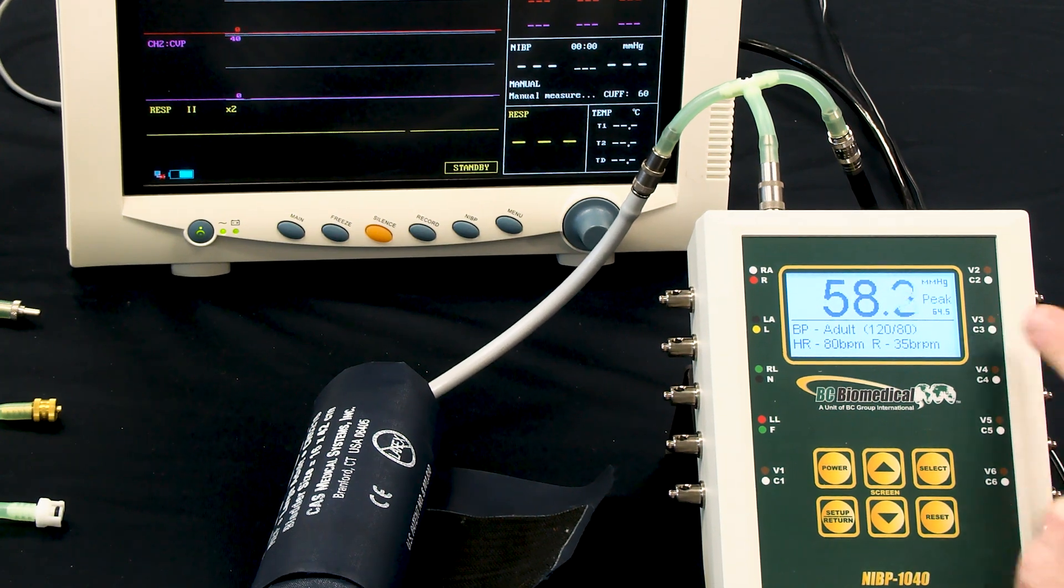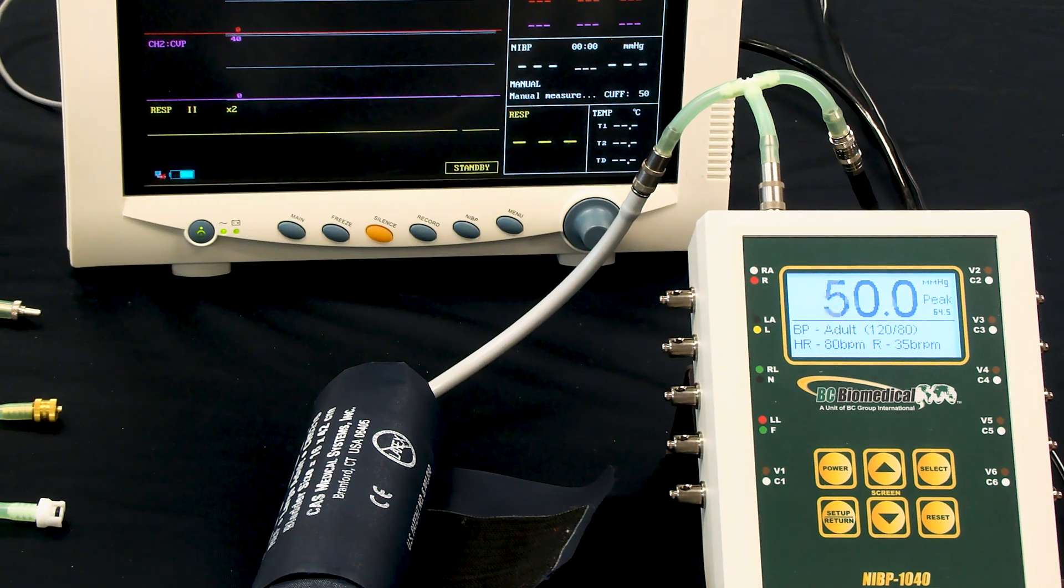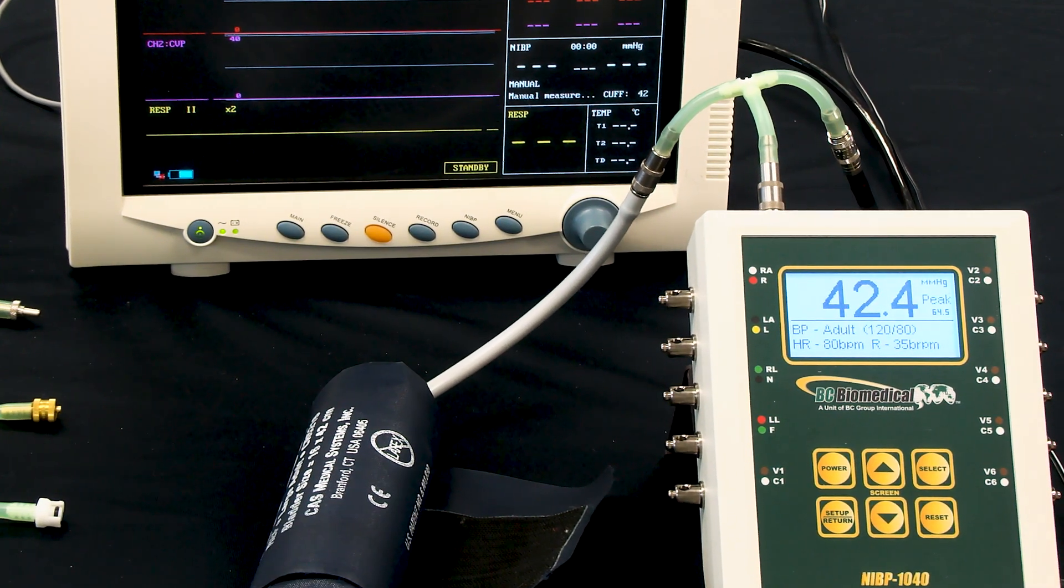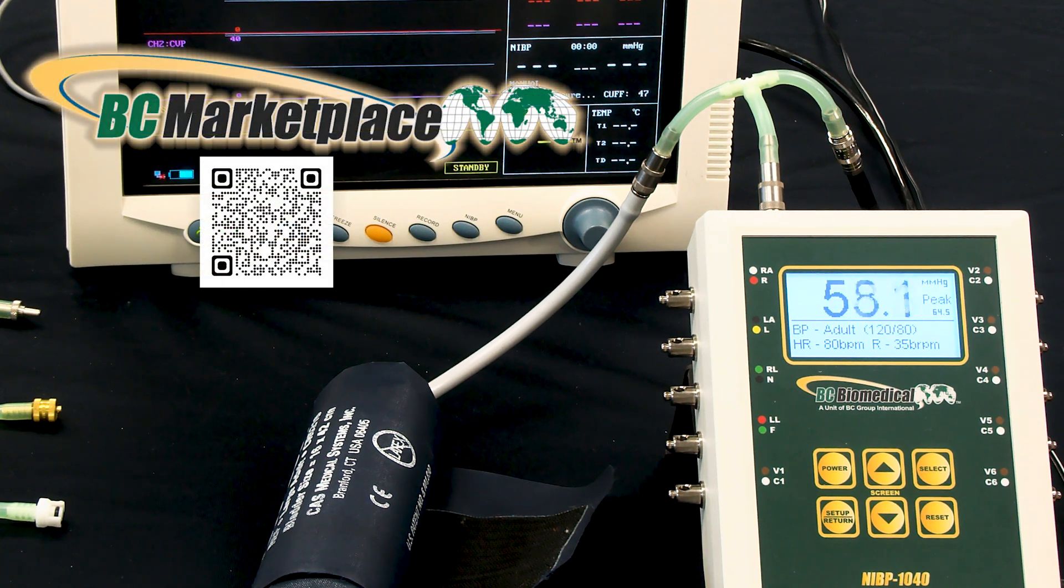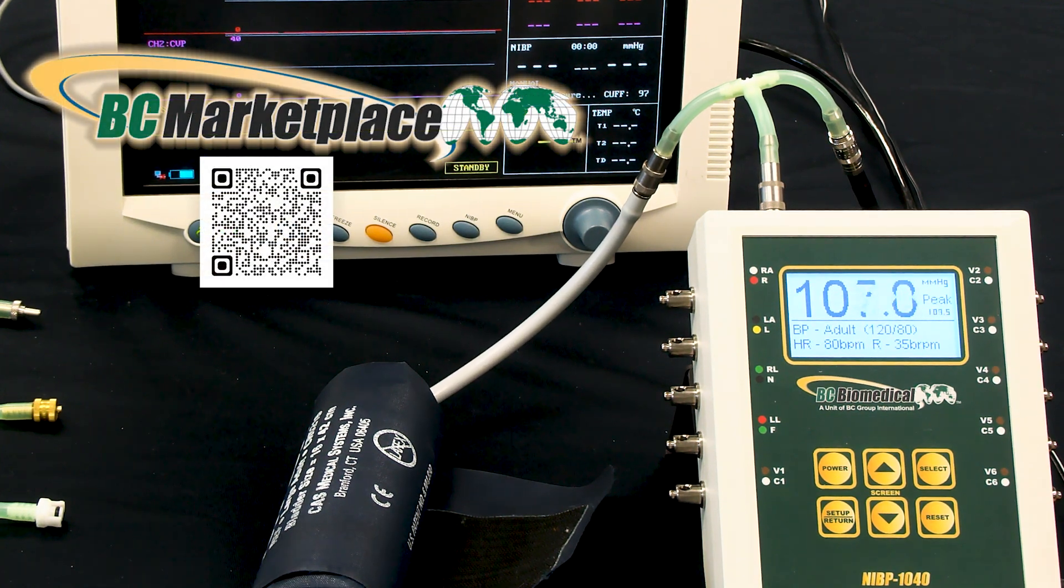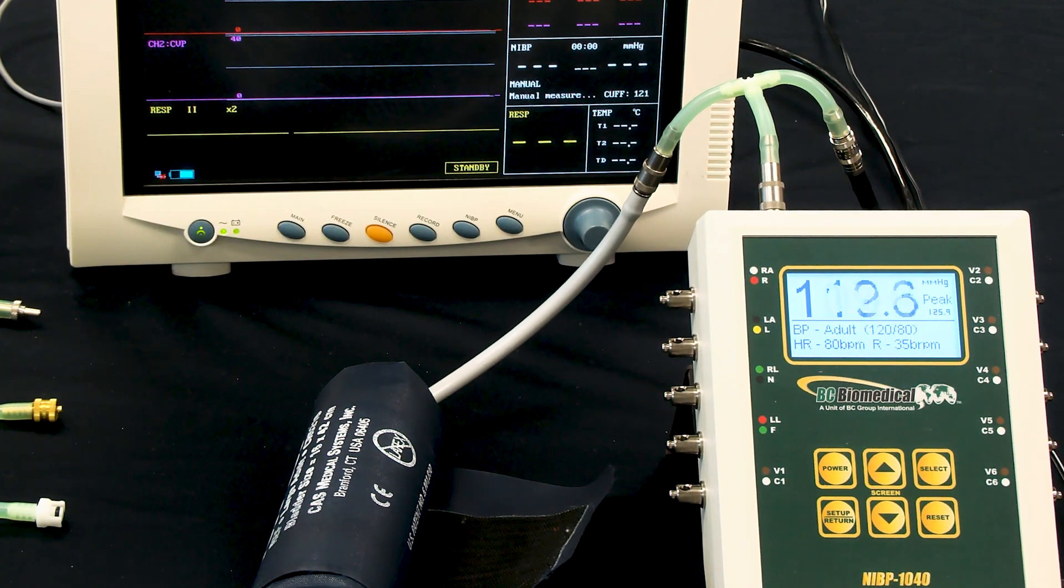Now this unit shows peak, but we have several various models of the NABP that are available. There's a compatibility chart available on the website that will show which model has each feature. So if you're looking for the peak pressure, make sure that you get a unit that does have that feature.